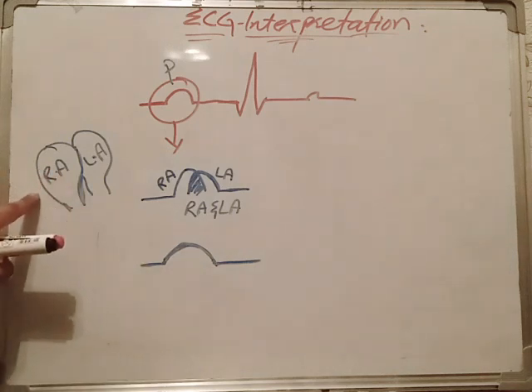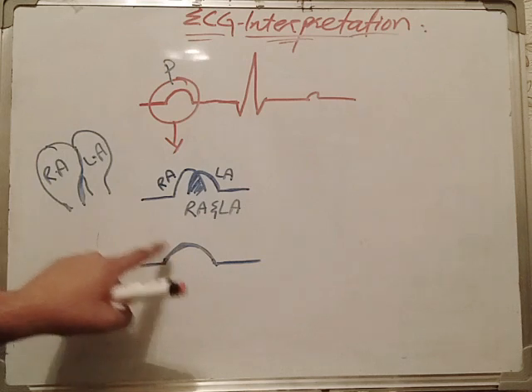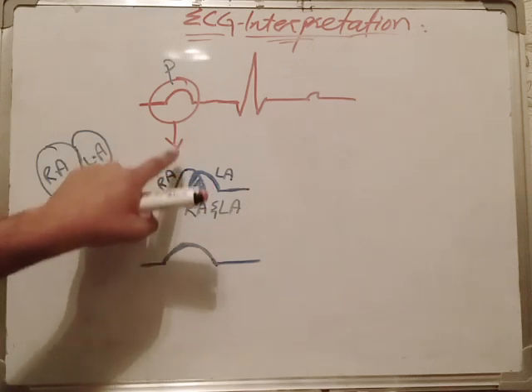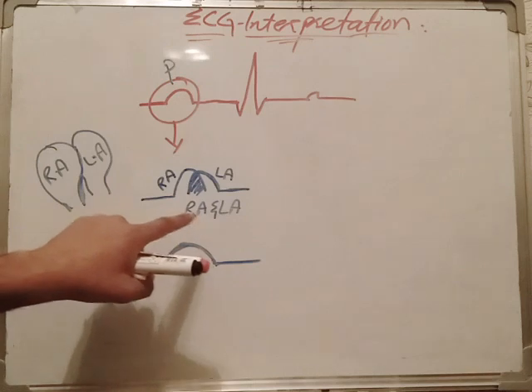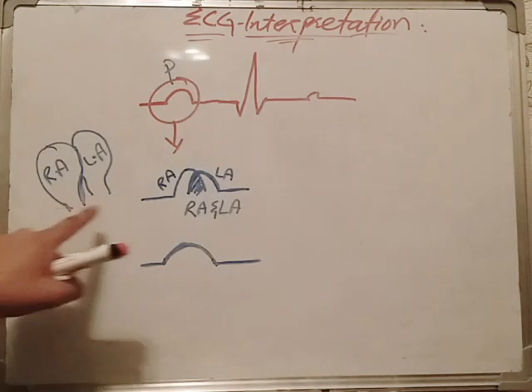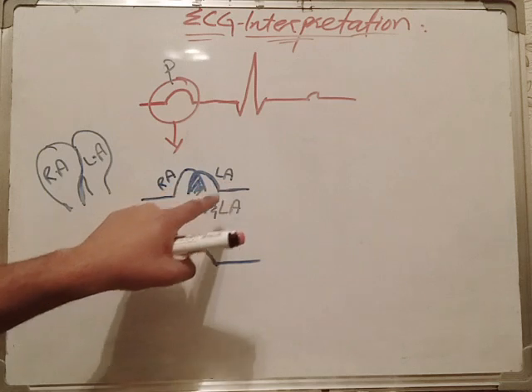If there is any fluctuation in the electrocardiography of both atria, then these two waves show fluctuations. For example, we will discuss later how the wave changes in right atrial hypertrophy and how it changes in left atrial hypertrophy.